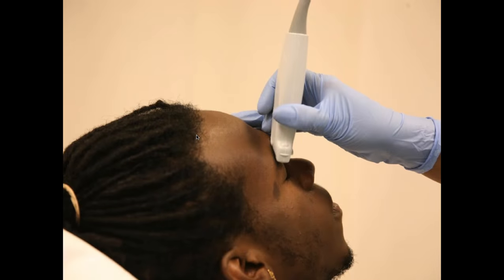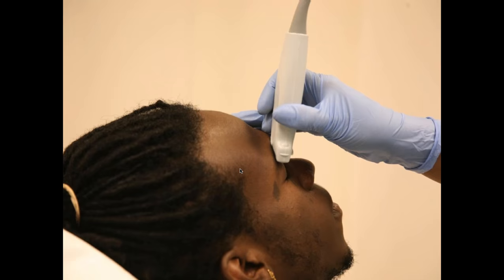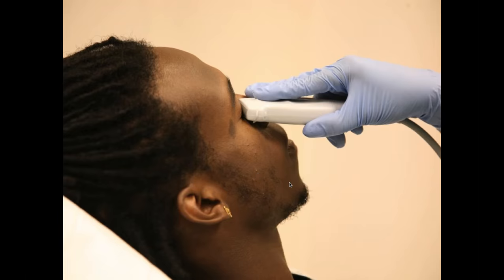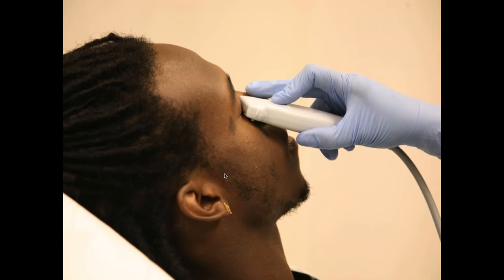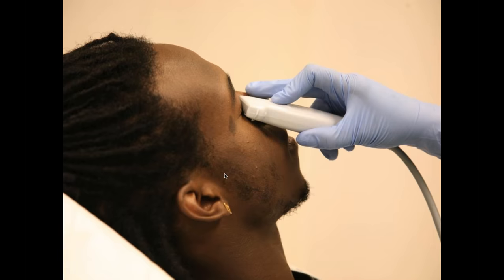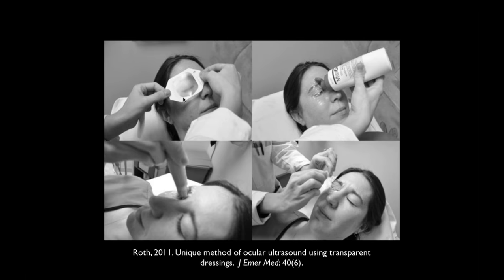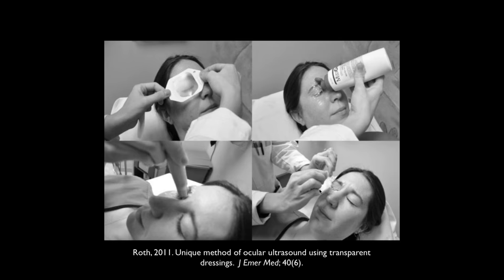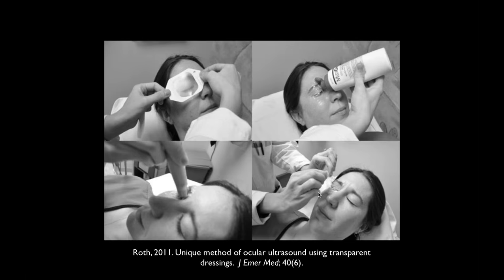In the transverse plane, start high on the patient's eye with fingers braced on their face, then fan down — that's the complete exam. Do the same with the probe indicator pointing toward the patient's forehead in a side-to-side fashion. The tegaderm goes directly onto the patient's closed eye, then you layer a generous amount of gel on top. At the end, the patient's eye is dry and comfortable — patients have very high satisfaction with this technique.